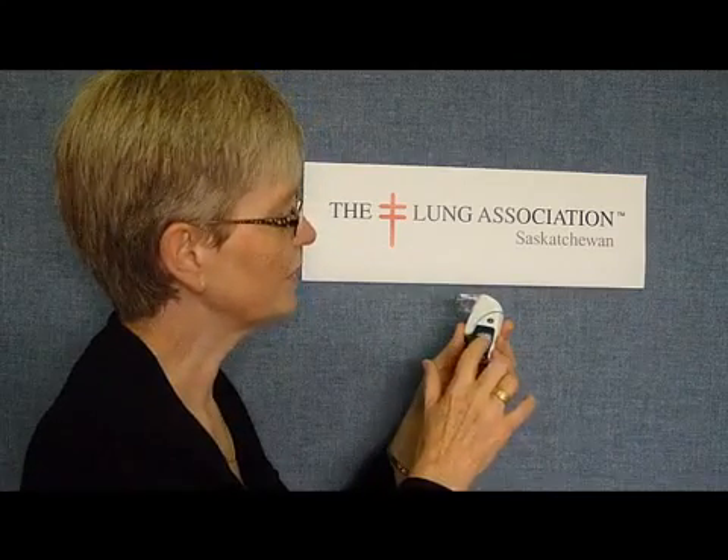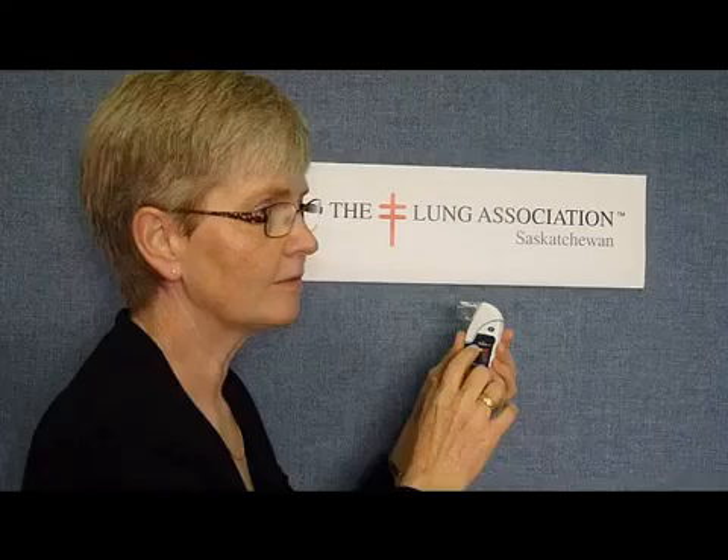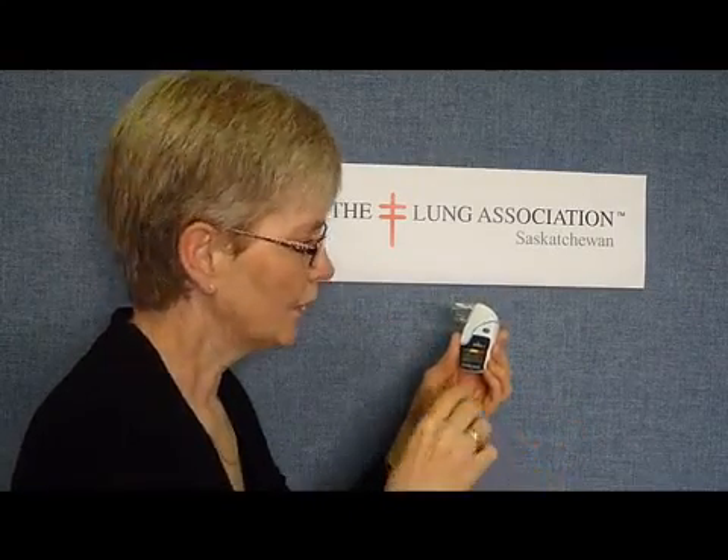This is a demonstration of how to use the PICO-1 peak flow meter. A peak flow meter measures the blast of air that you can blow out of your lungs, which is peak flow. It also measures the amount of air you blow out in the first second, which is FEV1. So both of those measurements are done on this machine.